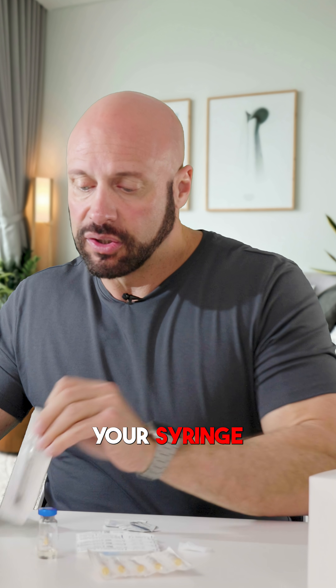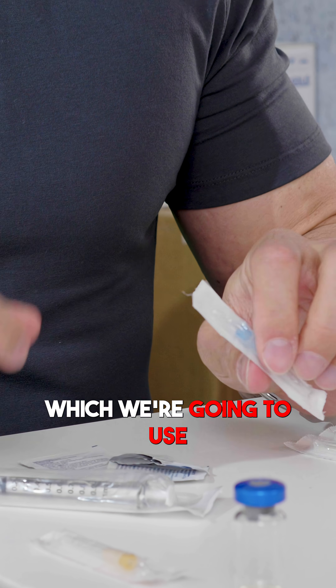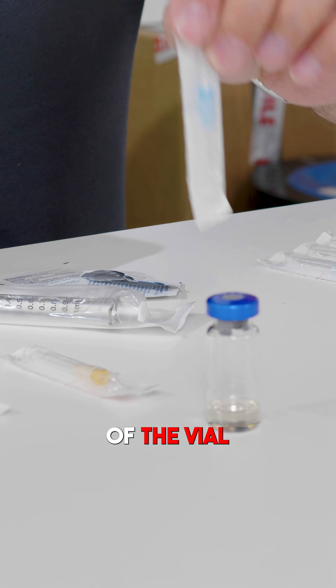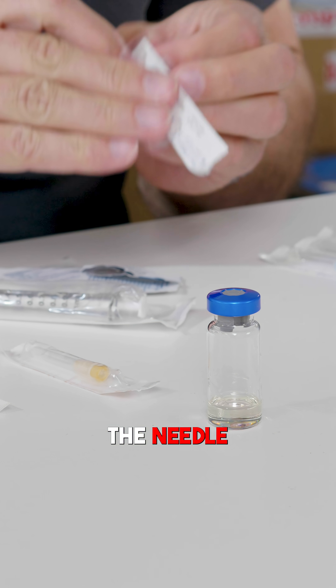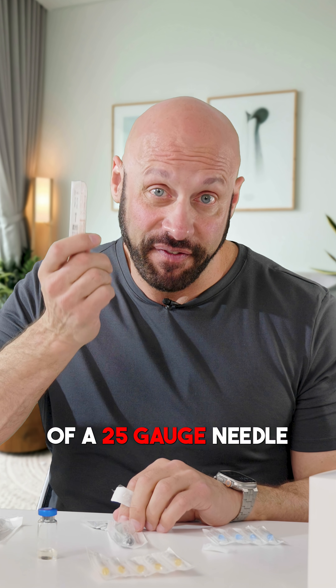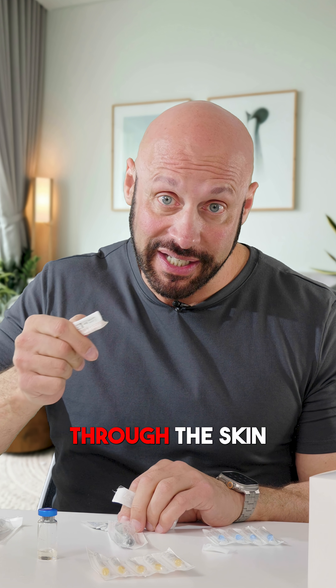Then you want to select your syringe and use your 23 gauge needle, which we're going to use only for drawing out. Because once you go through that rubber bung at the top of the vial, it will dull the needle. You could inject with it, but you also have the benefit of a 25 gauge needle — even thinner — to actually inject into your body through the skin.